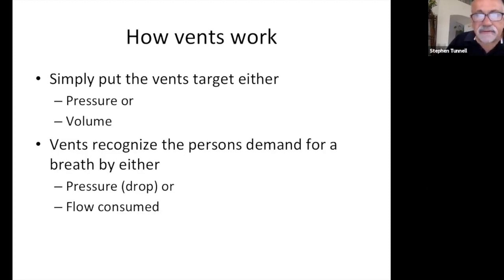And just as a point of reference, in talking to a lot of the doctors, we're seeing that the COVID-19 patients get put on a ventilator. We're trying to manage them with high flow devices, those cannulas and oxygen devices. When they're actually committed to a ventilator, they seem to be on for about 1 week.